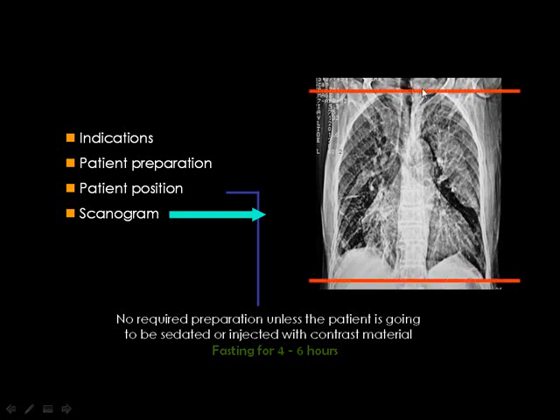We start from the apex of the lung until we finish at the costophrenic angle. Then the CT will ask you on the screen what the thickness or interval of the slices is. Would you like slices every 1 centimeter, half a centimeter, 3 millimeters, or what else? We usually scan the chest every 1 centimeter from the apex of the lung until we reach the costophrenic angle.